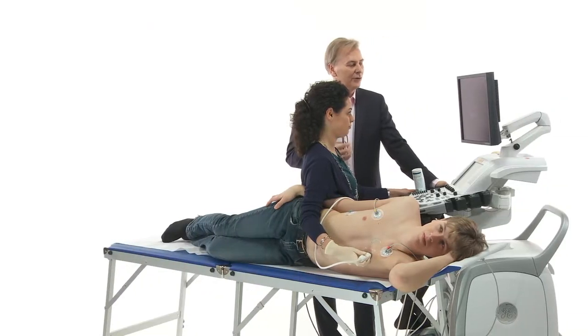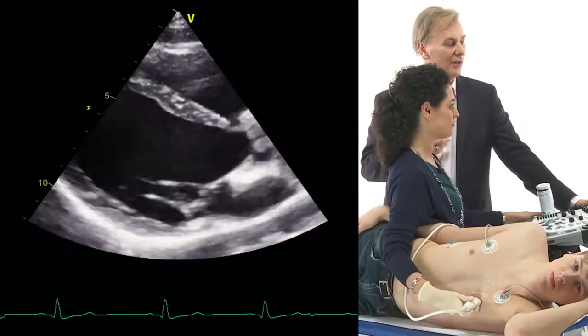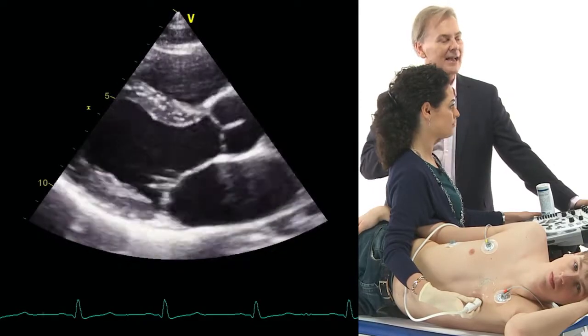I think this is so important to understand because it's a cut plane technique, and to understand we have to get a spatial representation in our head, and to do that we have to scan through the entire valve, and sometimes you will see pathologies only in one cut plane or at the edge of, let's say, the mitral valve. So to do that you have to image the valve like Anna is doing it by scanning back and forth. And to give you a better understanding of how the anatomy corresponds to the cut planes, we're going to show you some images now.